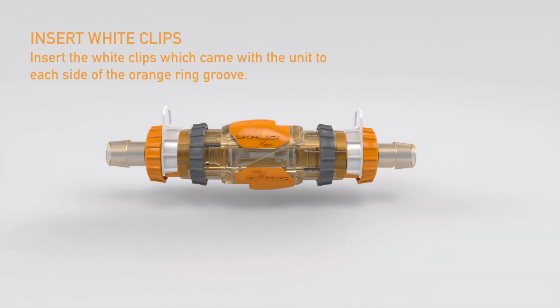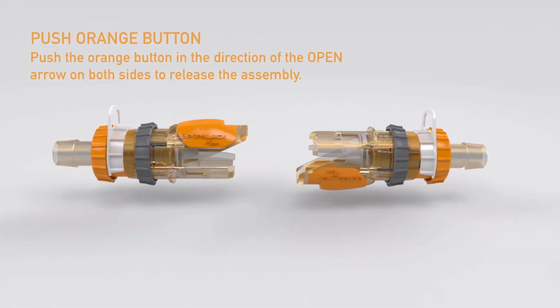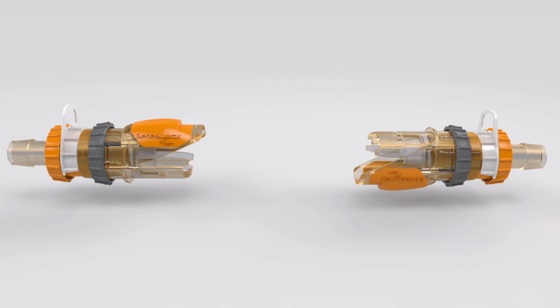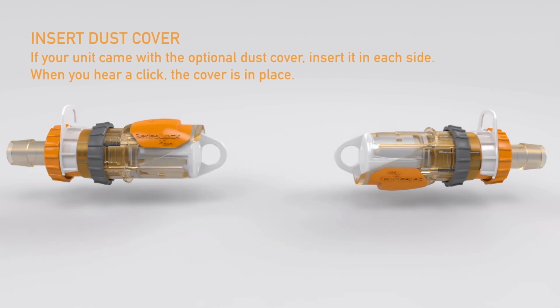Insert the white clips which came with the unit to each side of the orange ring groove. Finally, push the orange button in the direction of the open arrow on both sides to unhook both halves. When these buttons are slid at the same time, you can release the two pieces apart. If your unit came with the optional dust cover, insert it in each side. When you hear a click, the cover is in place.